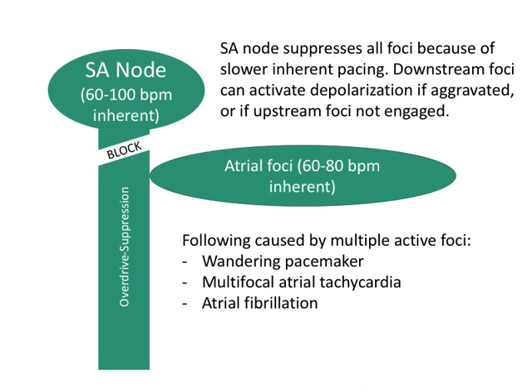Rhythm we introduced, we looked at the hierarchy of the nodes dictating rhythm of the heart. And we talked about how normally conduction goes in a certain order and overrides the slower pacemakers at the bottom, but if there's ever a block, and there are different levels of block. Remember, there's delay or intermittent block or complete block, but if there's something wrong with signal transduction at the different levels, that can result in a few different characteristics that we'll look at today.